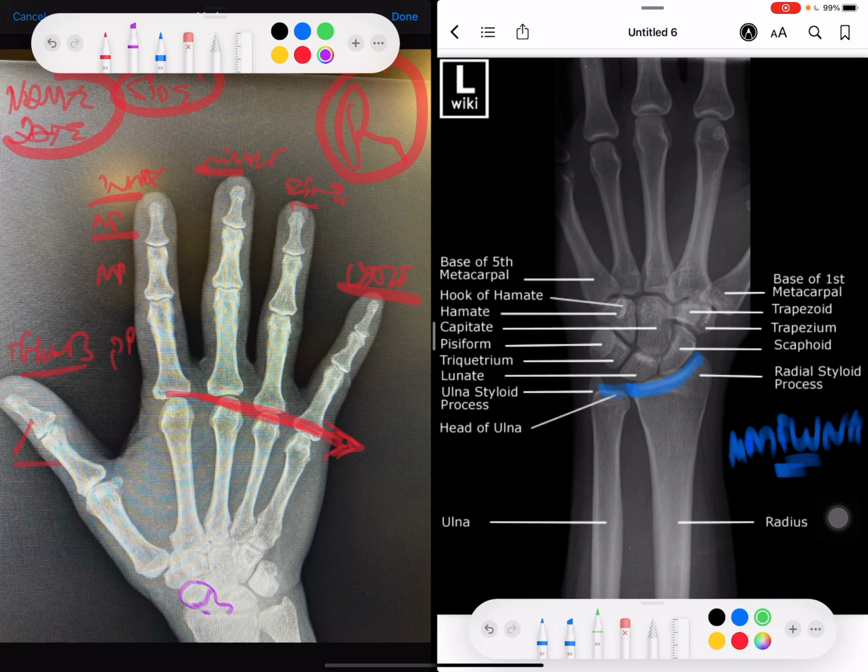So when you flex your fingers, technically they all will actually point a little bit at an angle towards the scaphoid. And you just gently relax. They always point towards the scaphoid. But if it's rotated, this bone right here, usually it's not exactly midline. They all sort of go at an angle. So when you really relax it, they'll actually flex towards the scaphoid.